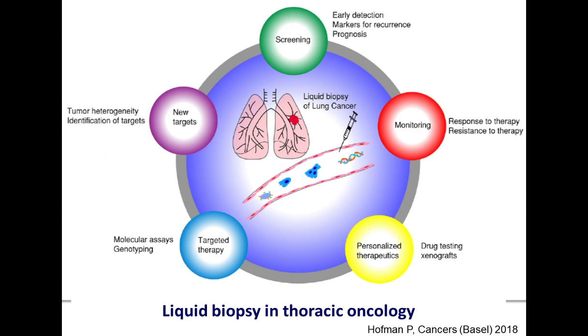Concerning the usefulness of liquid biopsy for lung cancer patients taking care, the main interest is currently for EGFR mutation testing. But besides this point, many other opportunities will be possible in the near future, such as liquid biopsy for screening of early diagnosis of lung cancer, and also large genomic alteration analysis using next-generation sequencing technology.